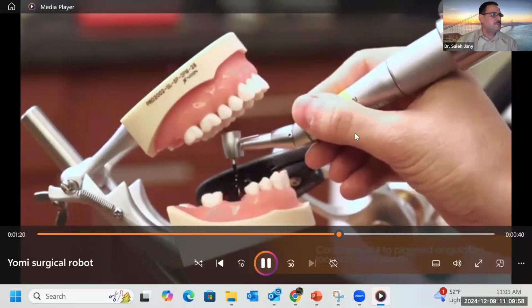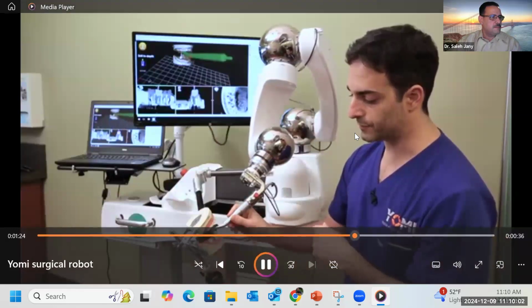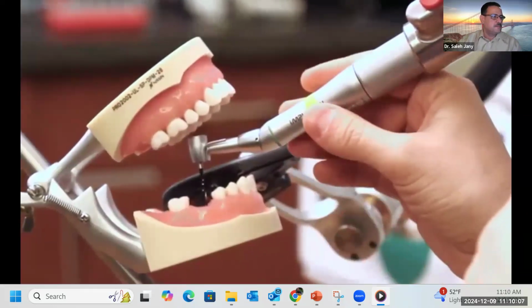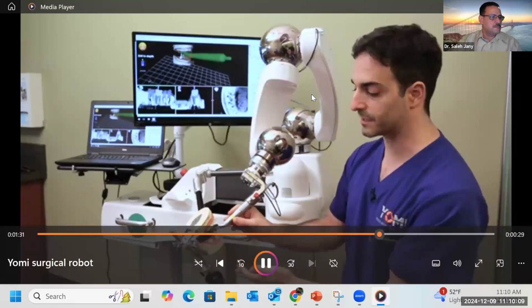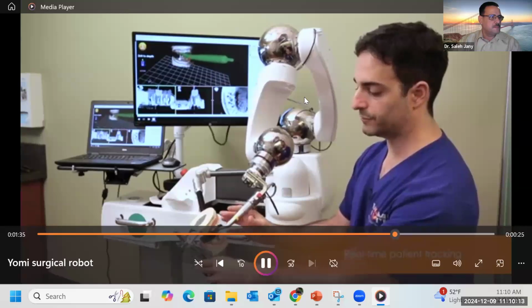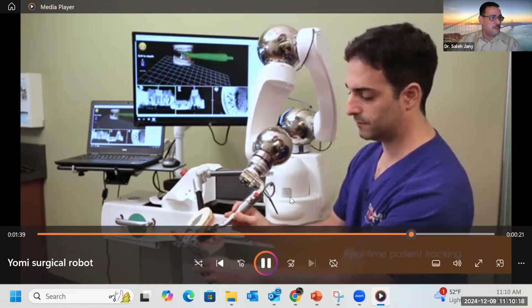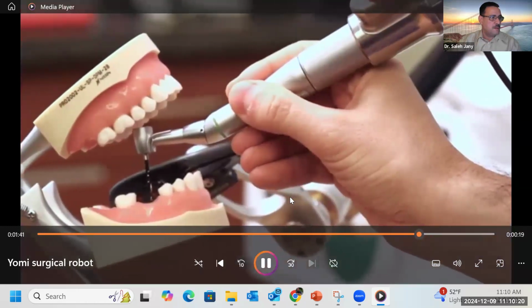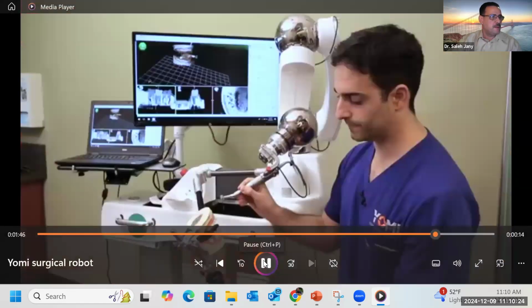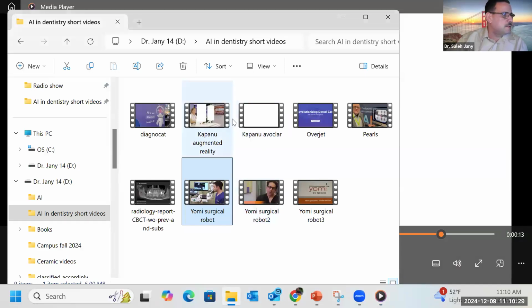The drill, the osteotomy, and then back out, and you'll notice if I let go, the system will only rotate about the axis, but it won't ever change position or angle. It'll stick with the planned trajectory. If I move the patient, you can see the drill will always follow with the patient motion. Complete the osteotomy, I keep pulling back, and it lets me into free mode. So this one, I'll show you the other one.